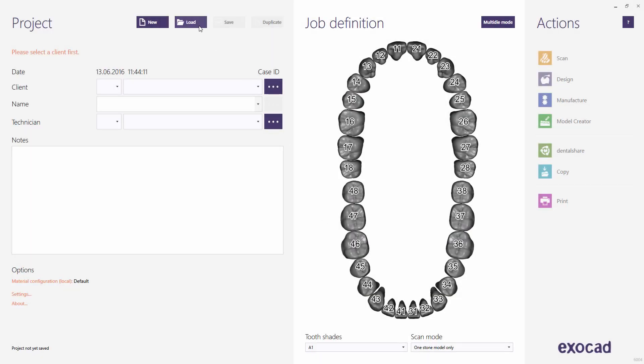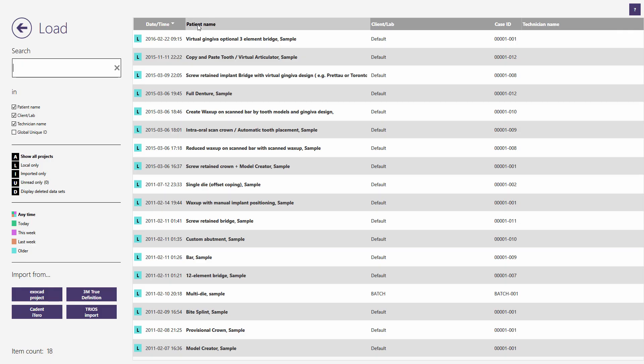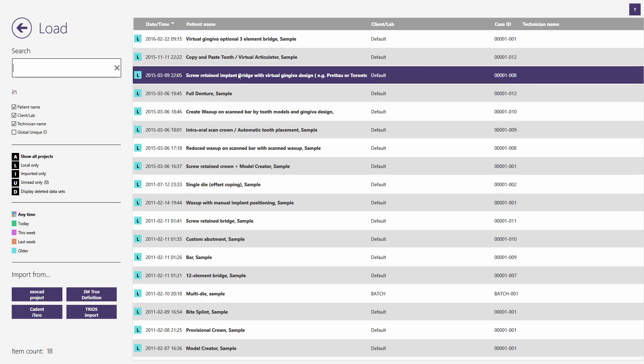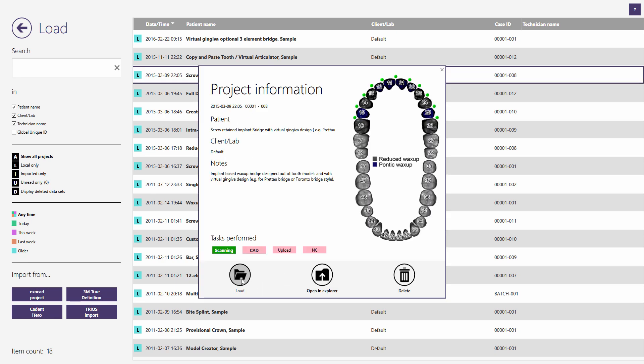This quick guide tutorial from Exocad shows how to use the Thimble Crown Cutback Library to design a Thimble Crown Implant Bridge. You may try this with the demo sample called Screw Retained Implant Bridge with Virtual Gingiva Design.